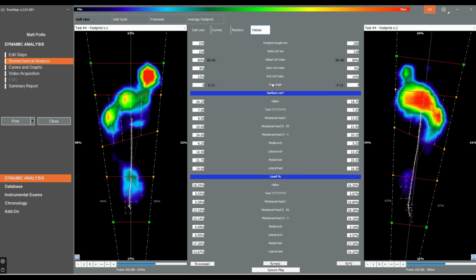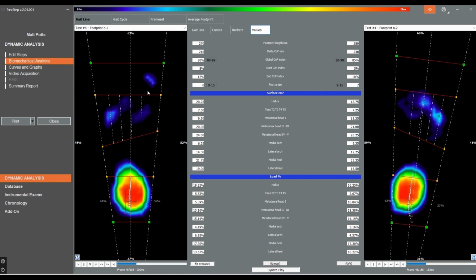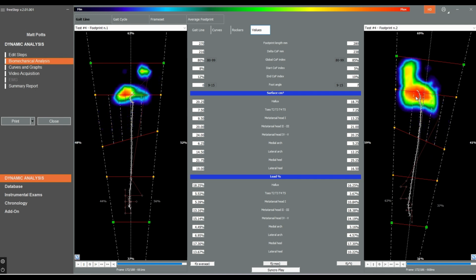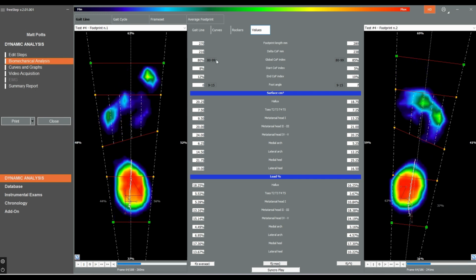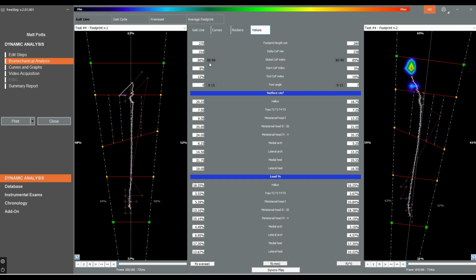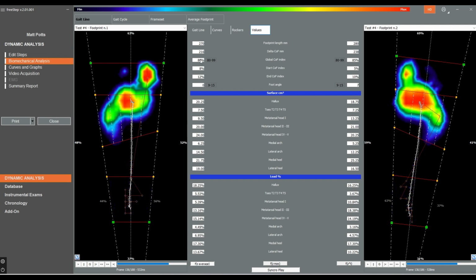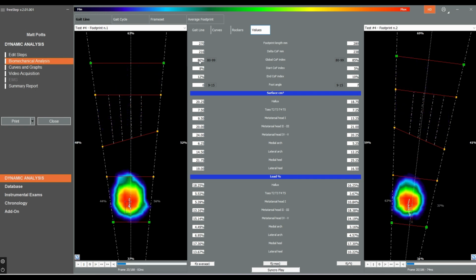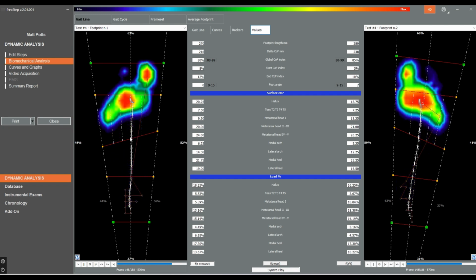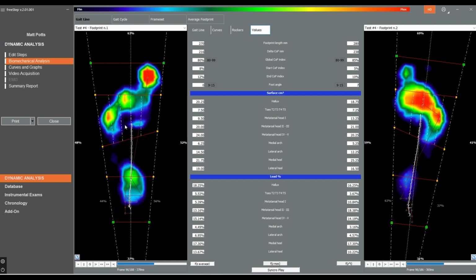So you can see the foot angle, which should be between 9 and 15 degrees, is 0. So very straight, left hip. And then slight external rotation of 7, so still low on this person. You can see here the global index is basically the percentage of the foot used, and you want someone to use between 80 and 99% of their foot. And so they're both within that range, but just particularly on the left. So this person, which is actually me, has a tendency to have less pressure going through the left foot.